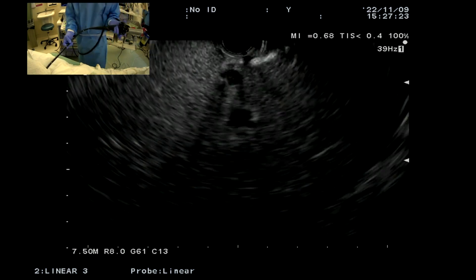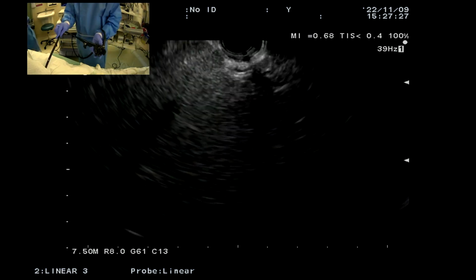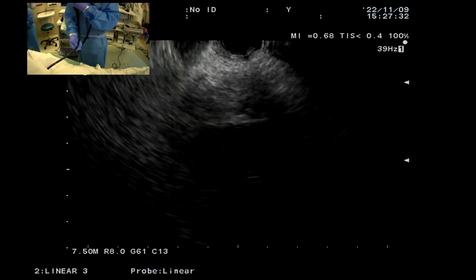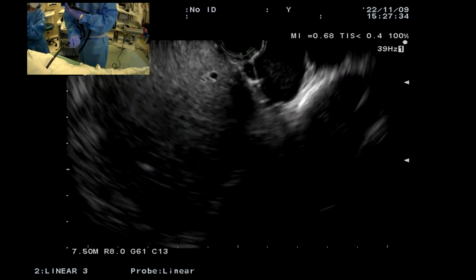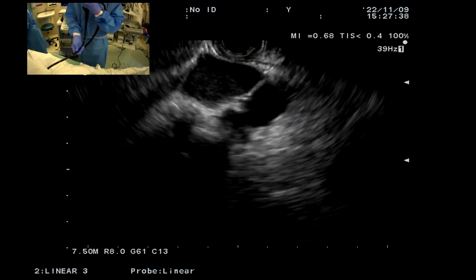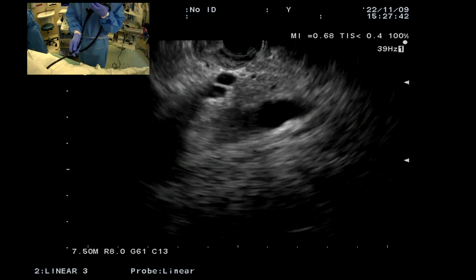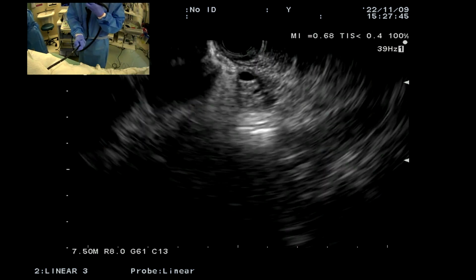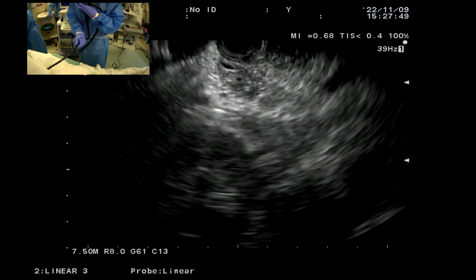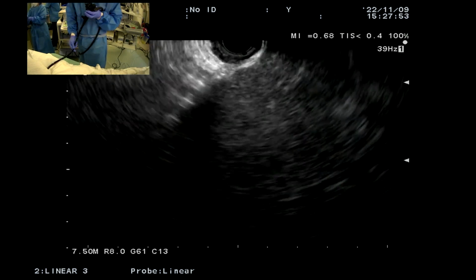And here's her liver, a little echogenic. Kidney. This is our biggest one. Okay, good. All right, that's the IVC. So again, the bile duct, cystic duct converging. PD is now below. This is right at 6 o'clock, the ampulla. All right, so we'll pull back now. So that looks all just fine.